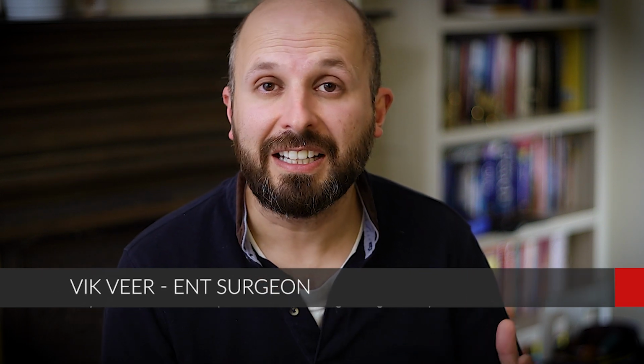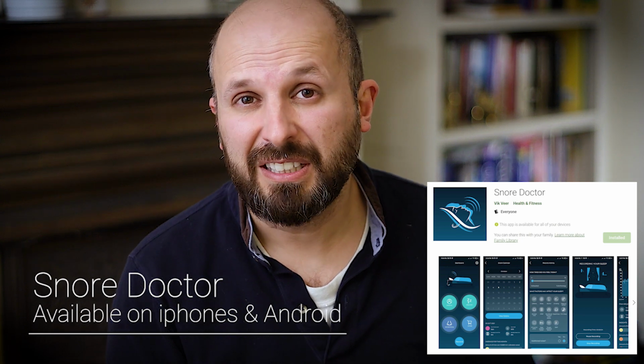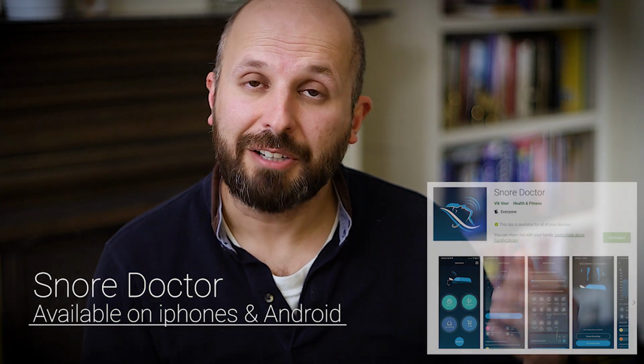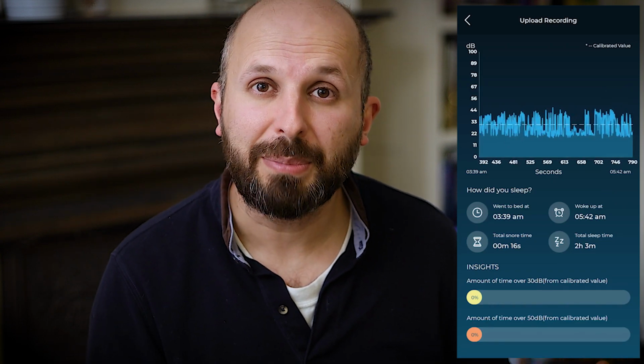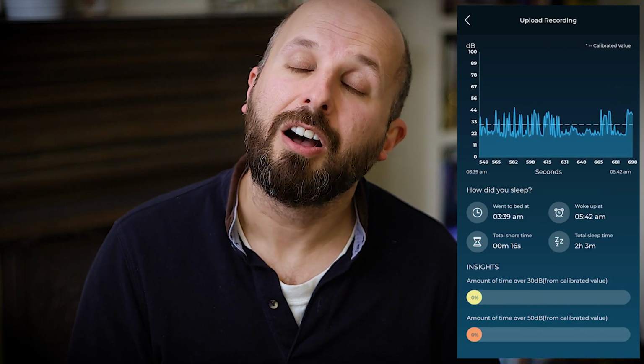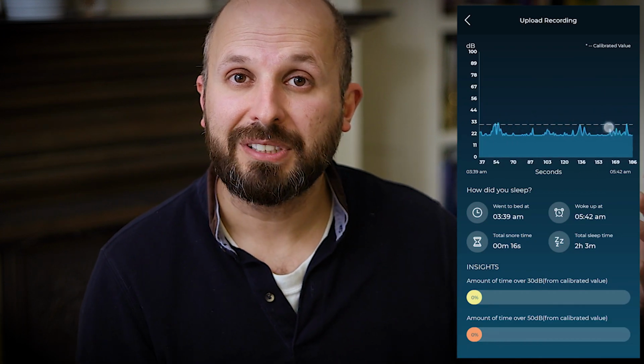I'd like to say finally I've managed to release my app called Snore Doctor. Looks a bit like that. Now, Snore Doctor is a relatively simple app. All it does is record the snoring noise that you make when you're sleeping at night. So if you're spending the whole night like that, it records that, measures how loud it is and then puts it out onto a graph for you to look at in the morning.